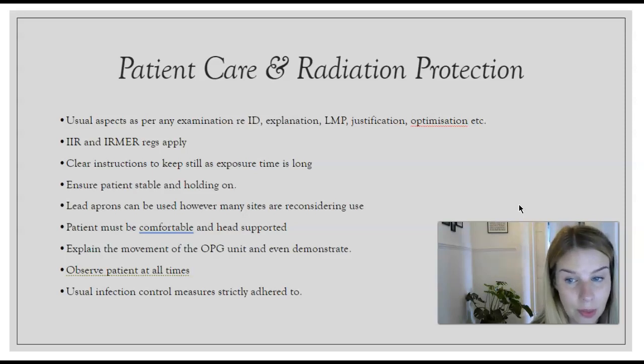Ensure that the patient is comfortable. If they're not comfortable, chances are they're going to move. So you want to make sure that they're as comfortable as possible, which isn't always easy, especially if they've been punched in the mouth or they've had some sort of trauma to the mouth. It's not very comfortable asking them to stand and bite onto something for, I think it's like 11 seconds or something like that. So it can be quite tricky for them to be comfortable, but you just want to try and make sure they're as comfortable as possible.